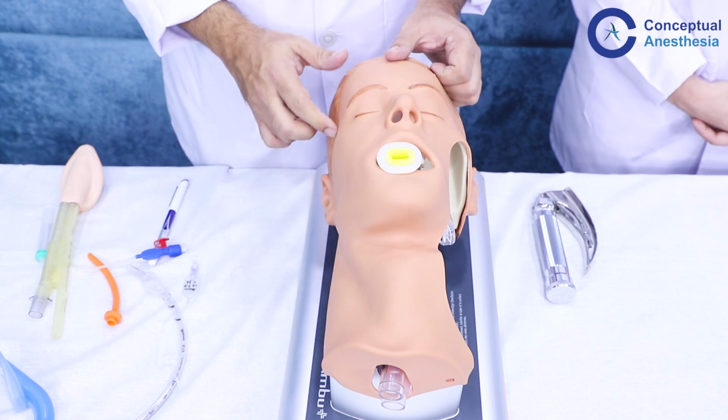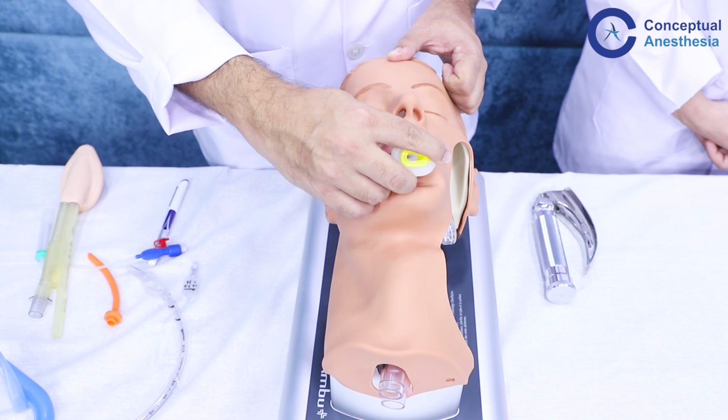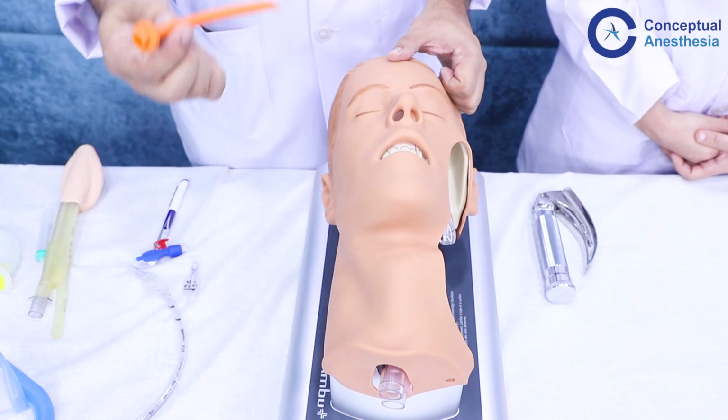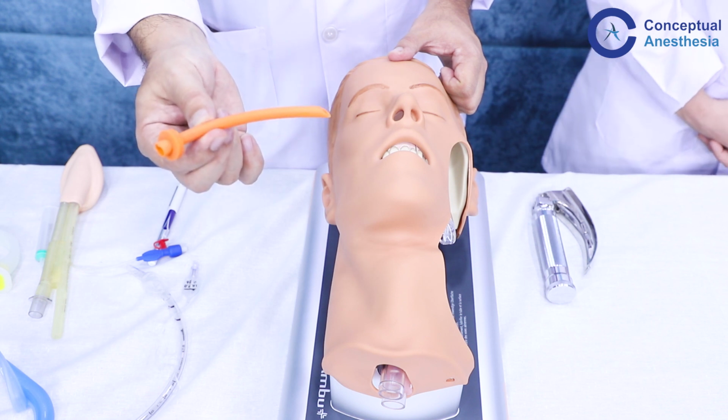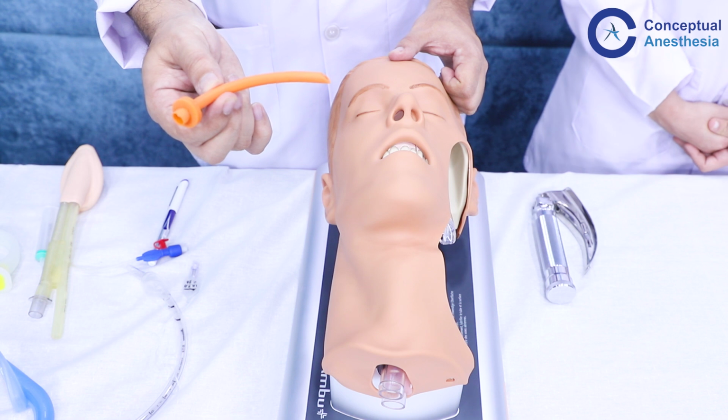So these are the 2 techniques. Now, if your patient has less mouth opening and there isn't space to put an oropharyngeal airway, or if there's trauma of the mandible, we can use a nasopharyngeal airway instead. So this is a nasopharyngeal airway with an adjustable flange.